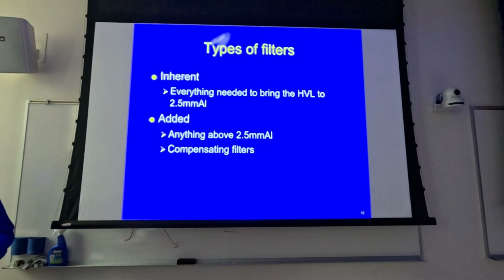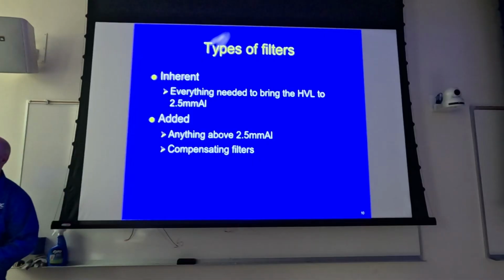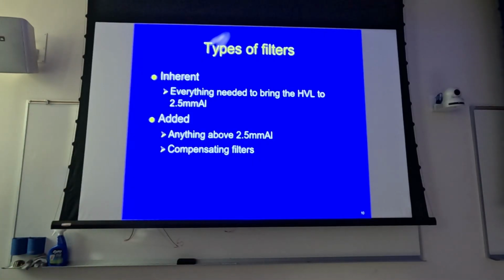And that would be because you couldn't see the entire foot all in one image. Not with one technique, you couldn't see it well. So we had to have different techniques for different parts of the anatomy. Or we could use a compensating filter, a wedge filter, that would compensate and even out those tissue density differences. You just don't need that anymore with DR. It kind of takes the place of that. So that would be an example, though, of additive filtration.